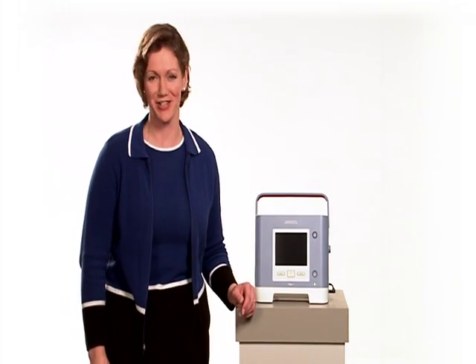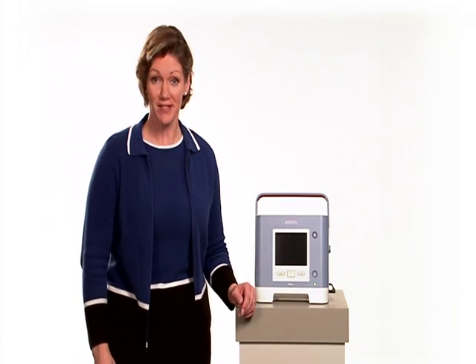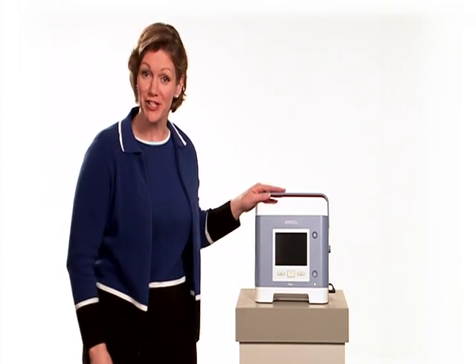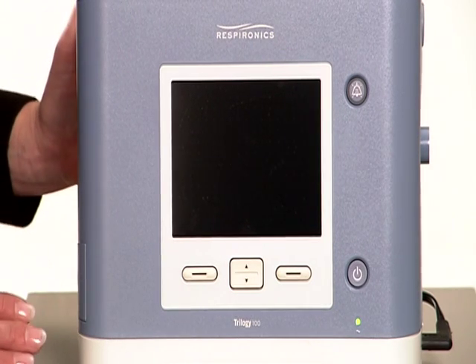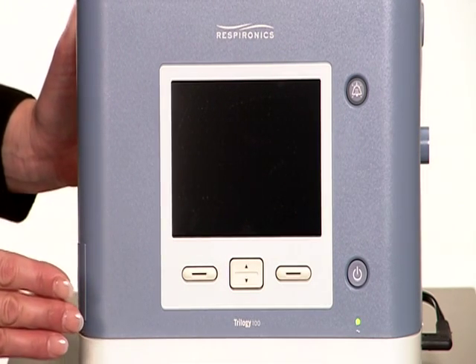Trilogy100 is a small, portable ventilator that's easy to use. To become familiar with the system, let's take a good look at the unit itself. Here on the front, you see control buttons, visual indicators, and the display screen.